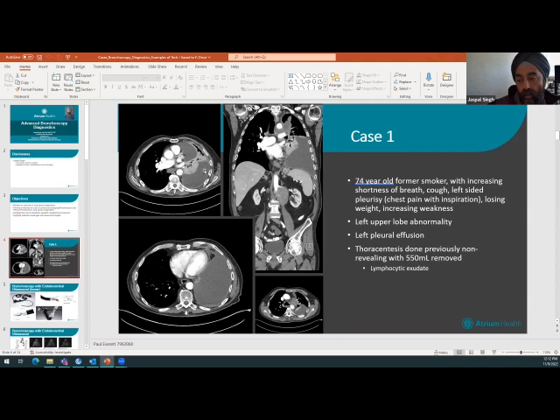This is a large, what we call a pleural effusion, which is fluid around the heart, around the lung. This is the lung when it's collapsed. It looks like a little spongy gray thing. This is more fluid here. And then there's oftentimes a mass or something else nearby that we really can't see very effectively. And sure enough, there's a mass hidden up here that's just not easy to see. And that mass is causing a collapse of the airway from the outside, as well as some fluid around the outside.